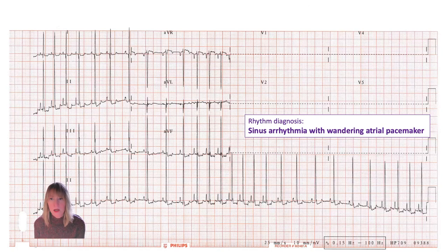And so my interpretation of this was that this could still be a fairly dramatic sinus arrhythmia, normal rhythm, with what we call a wandering atrial pacemaker, which actually can be a normal finding in the setting of sinus arrhythmia. So look out for this finding. Now you know how to approach it. And we'll contrast that with something a little bit different in our next episode. Thanks for joining. See you again.